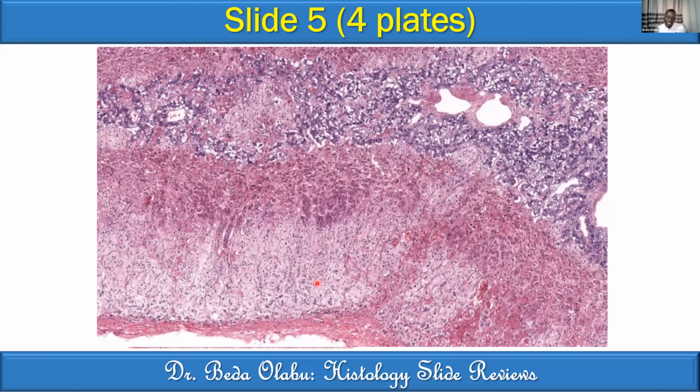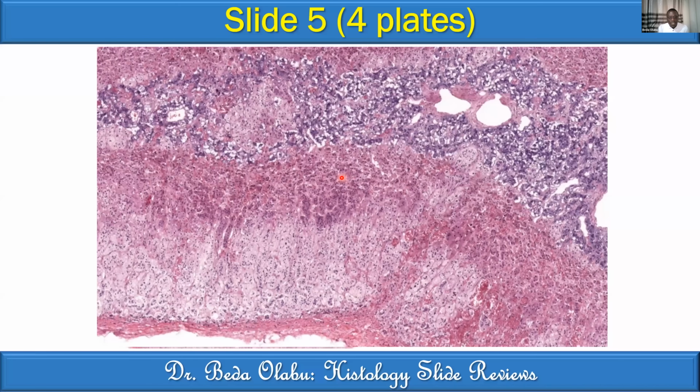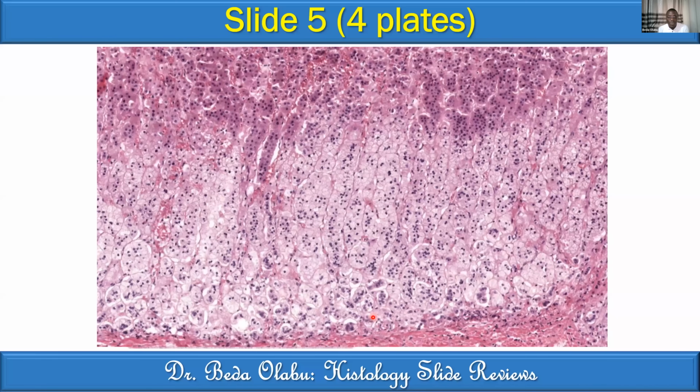Let's talk about the adrenal cortex. I'll give you a fourth magnification that I didn't give you earlier intentionally. But at this third magnification, you appreciate that that's the capsule. The lower part there is the capsule. It's a dense connective tissue capsule. At this highest magnification, the fourth one, which I didn't give you, I want you to appreciate the zones of the adrenal cortex.